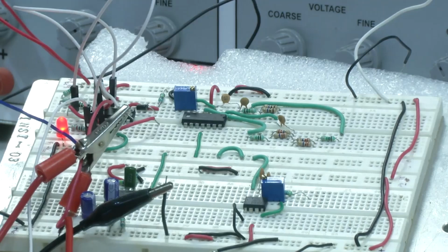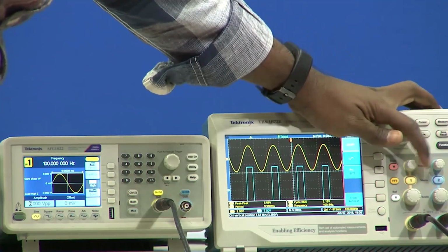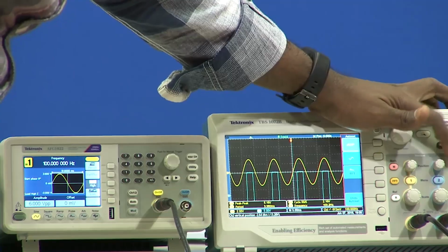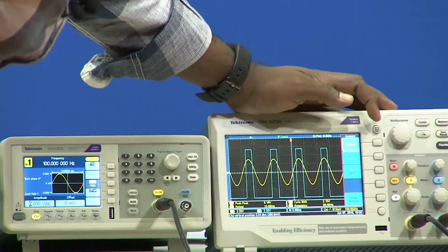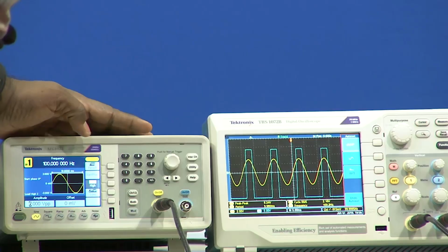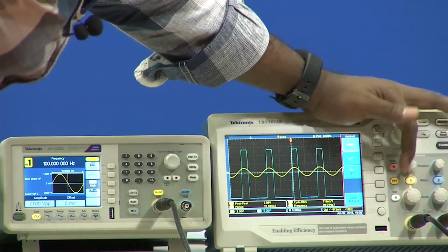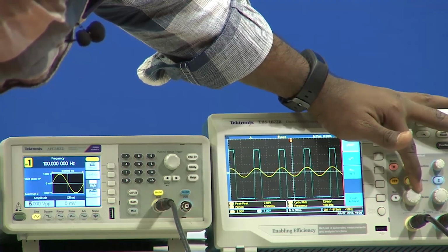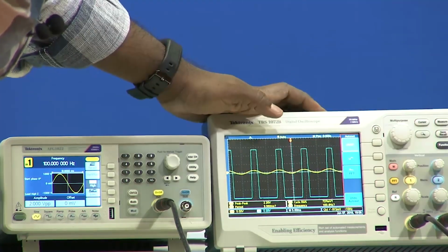When I look into the oscilloscope, right, let me keep both the things to the same point, so it is easy for us to understand, and this point too, changing the offset value, right, and the input also I will change to the same 2 volts peak to peak, so it is easy to understand, and let me change the input range to 5 volts, right. So, both are at the same point.